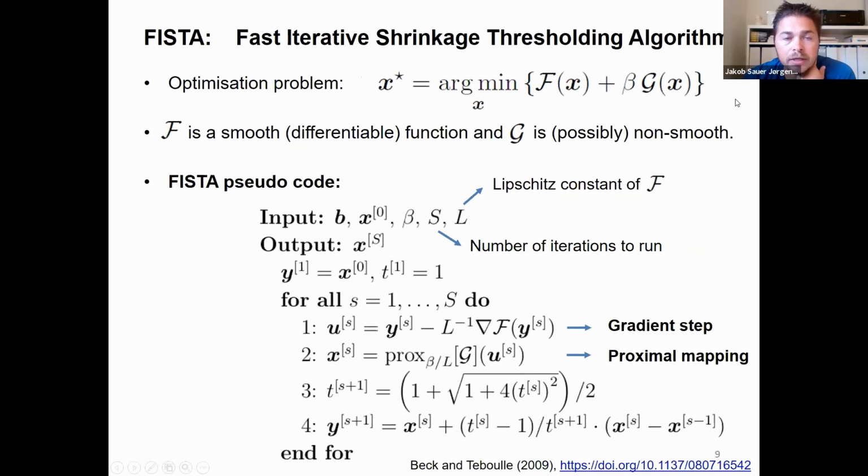Now, the other thing that we can do is we can use methods for non-smooth optimization. And here I'm just going to talk about one particular method, one of the simpler ones. We provide other ones in CIL as well. So for non-smooth problems, we look typically at problems of a particular form and then derive algorithms that are suitable for this form.